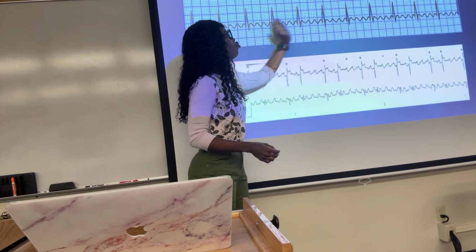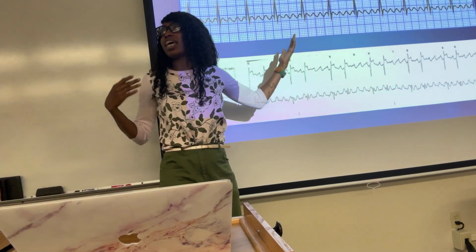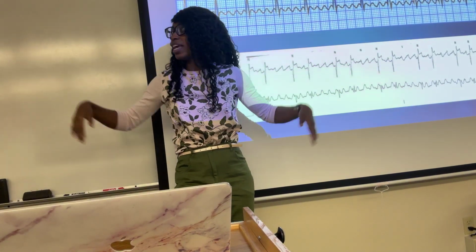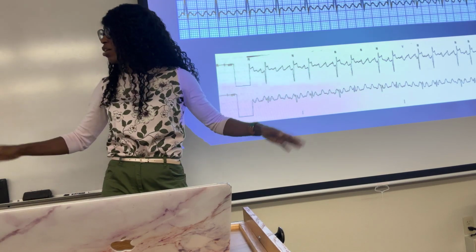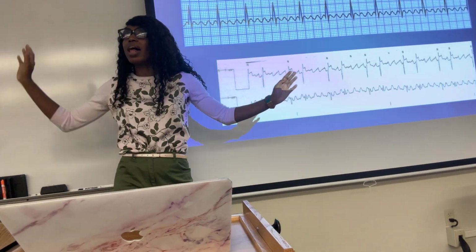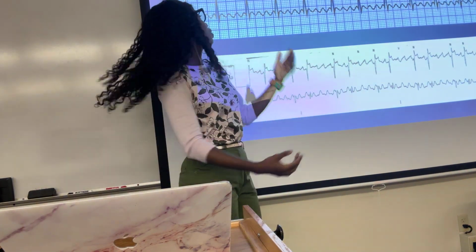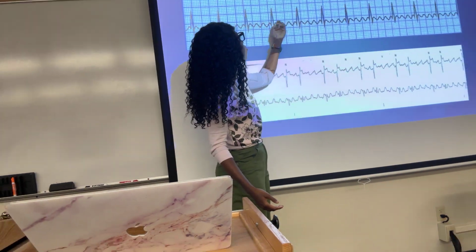It's structured, right? So when I think of this, I think about a butterfly. They're rhythmic. They beat the flutter. Their flutter is calculated, rhythmic, same speed, same rate. So that's what I think about. This is the flutter of a butterfly.